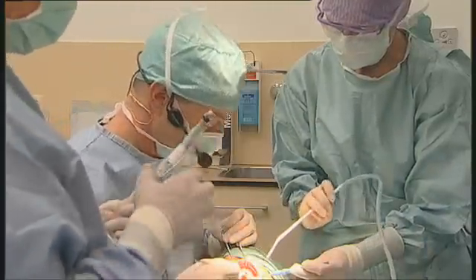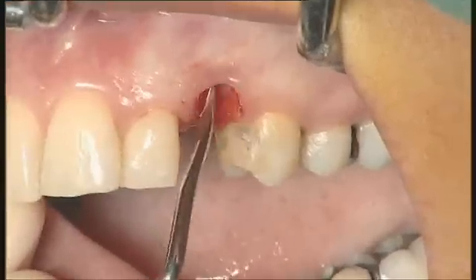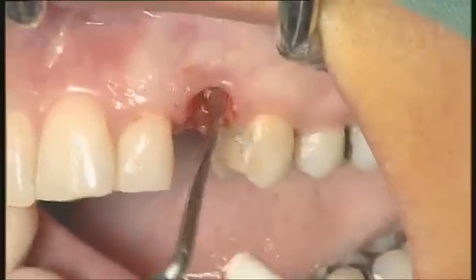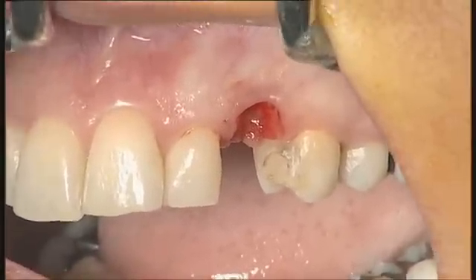I'm checking the quality of the so-called socket here. We have some soft tissue on the palatal. Now I'm ready to start the drilling procedure.